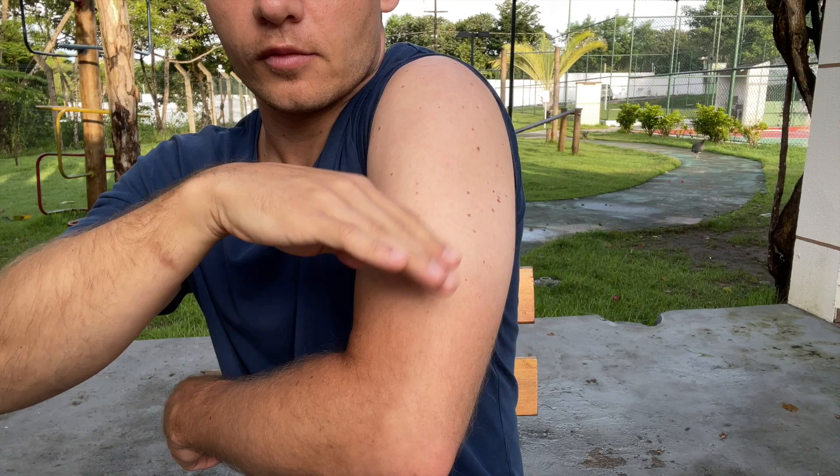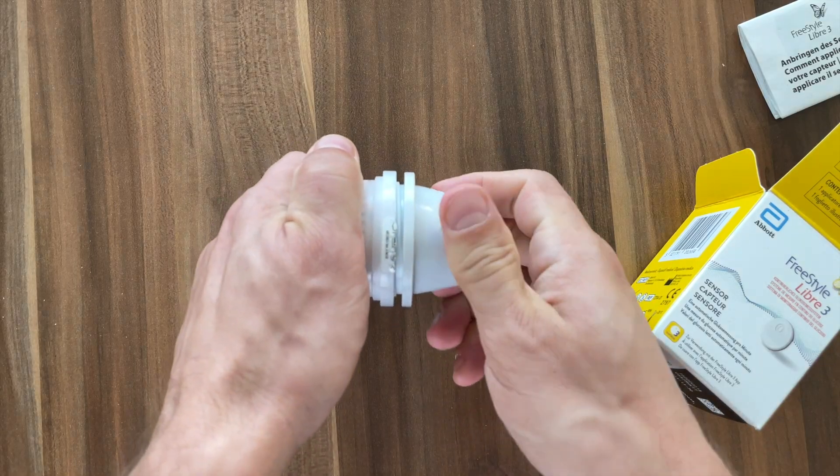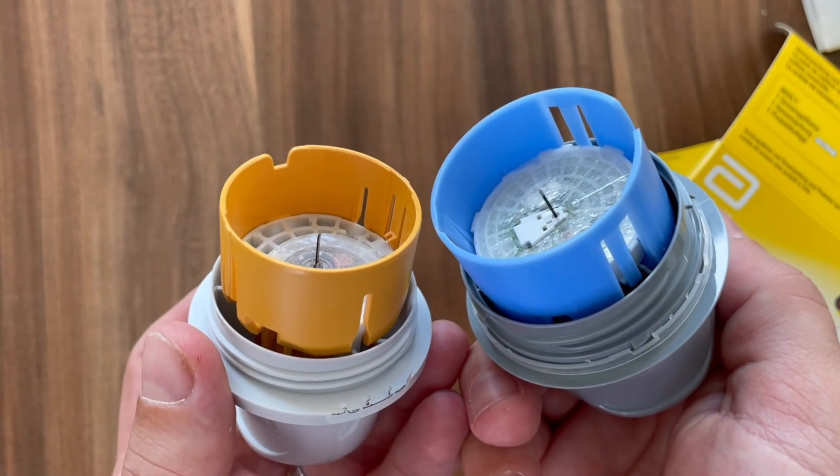Wait until your skin is completely dry, and in the meantime you can unscrew the cap from the sensor applicator. If you're scared of needles, don't look into the applicator because the needle is quite big. But the insertion doesn't hurt, so don't freak out — just don't look at it.